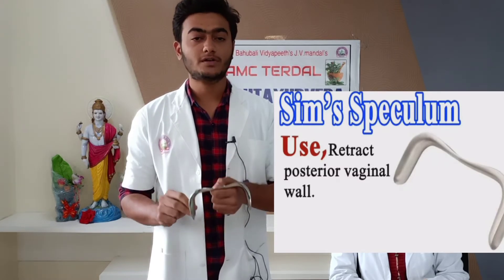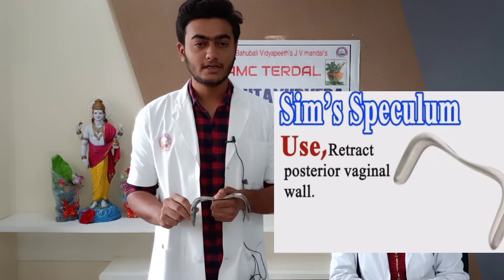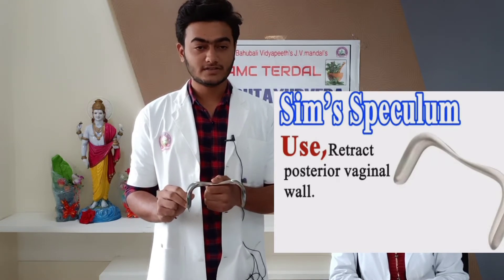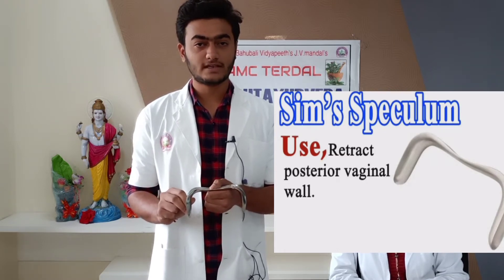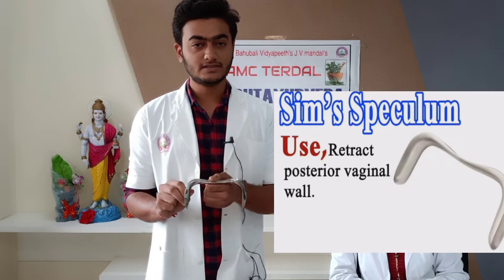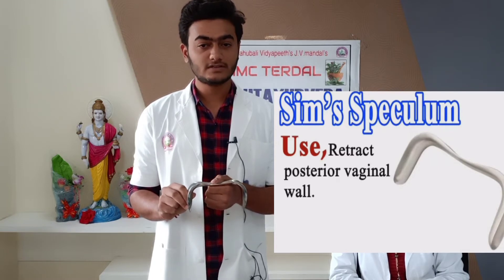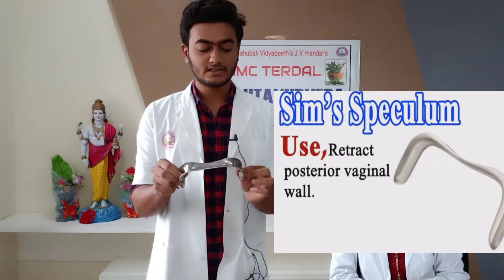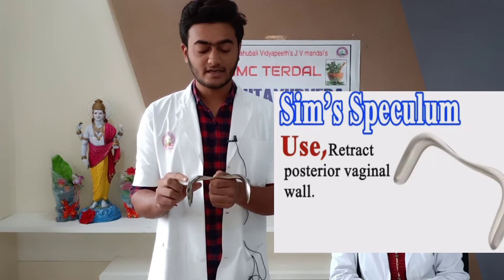This is a Sim's Speculum. It is commonly used to retract the posterior vaginal wall, but it can also be used to retract the lateral and anterior vaginal wall. Its gynecological uses: it is used for the inspection of the cervix and vagina, to perform minor procedures over the cervix and vagina, and for operations through the vaginal route. Its obstetric uses are to perform examination during pregnancy and for diagnosis of conditions in pregnancy. It is used in procedures through the vaginal route and during pregnancy. To identify this instrument: it is either a single-bladed or double-bladed metal instrument, made of stainless steel, and present in different sizes.